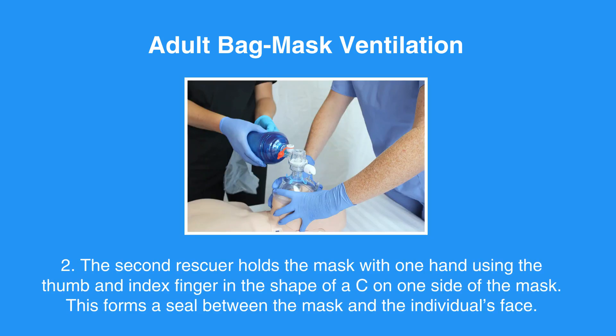The second rescuer holds the mask with one hand, using the thumb and index finger in the shape of a C on one side of the mask. This forms a seal between the mask and the individual's face.